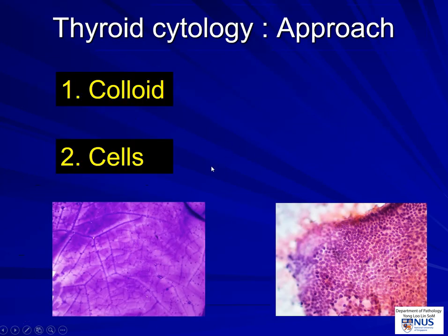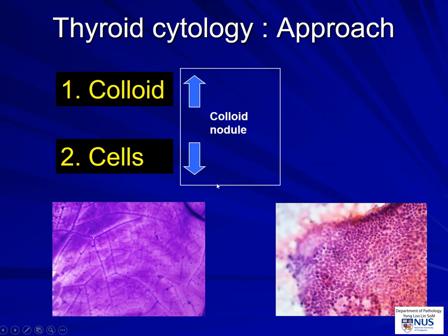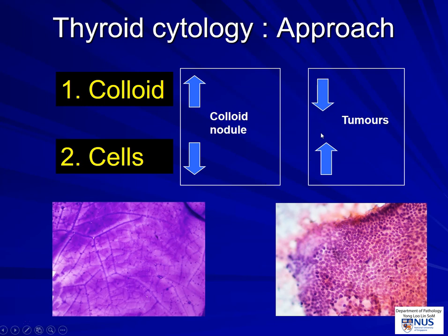Now let's look at the main elements of thyroid cytology. There are always two things we really want to focus on: colloid and cells. A rule of thumb is that if you see abundant colloid, especially thin colloid and not so many cells, you are more in the territory of a benign nodule. Whereas if you see less colloid and more cells, these are more often associated with tumors. Of course, these are not hard and fast rules — you can have very abundant cellularity in hyperplastic benign nodules as well.